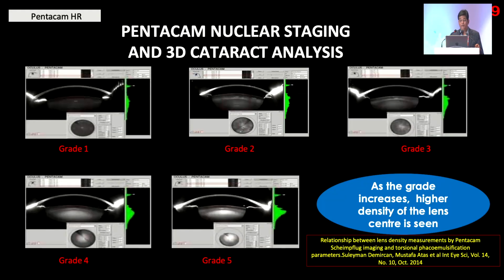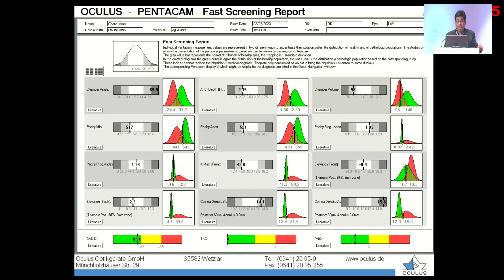It does have a nuclear staging and a 3D cataract analysis, which can be done using the Scheimpflug imaging. Also, something which is not used as often as it should be is the fast screening report. And this is what it looks like.